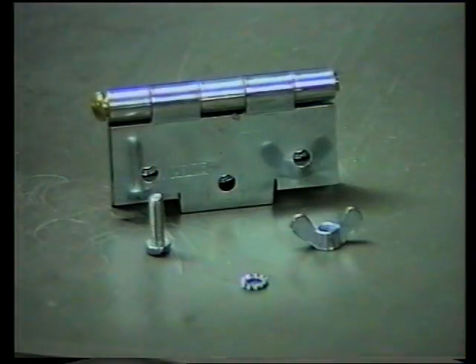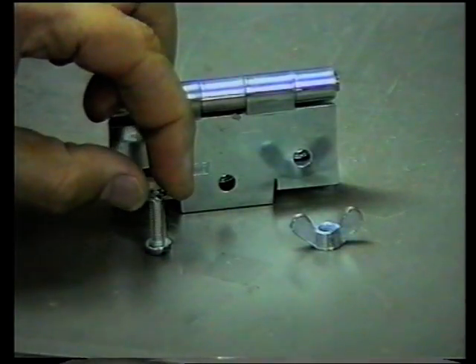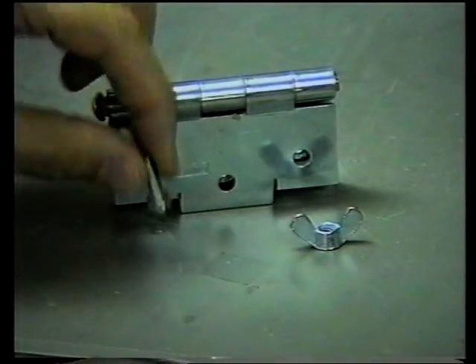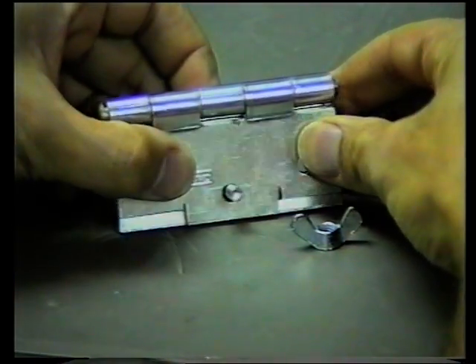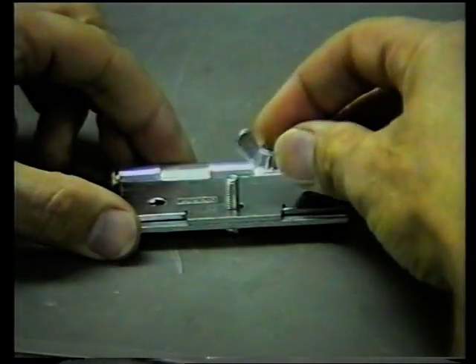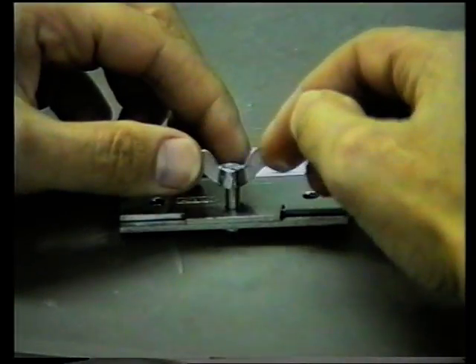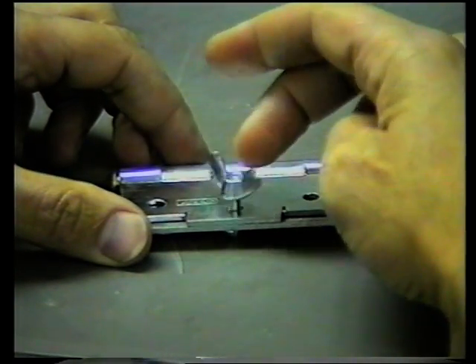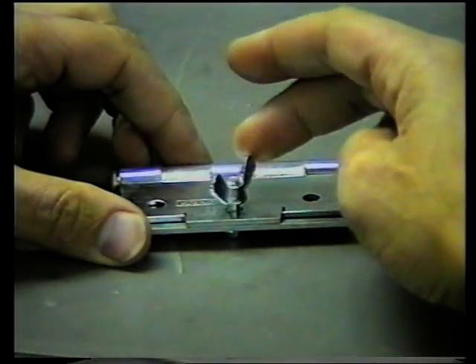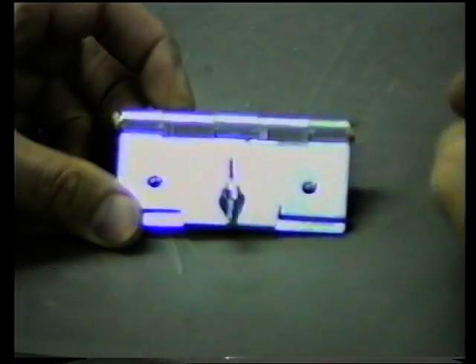The screw serves to tighten the clamp, and for that you need a screw and a washer. The nut is the wing nut of sufficient size to exert good power on the closing of the door hinge blade breaker.